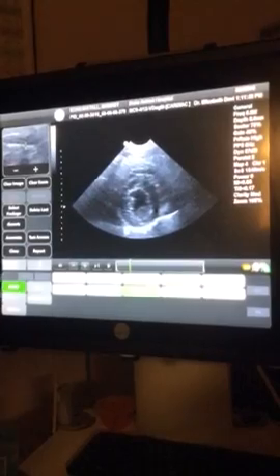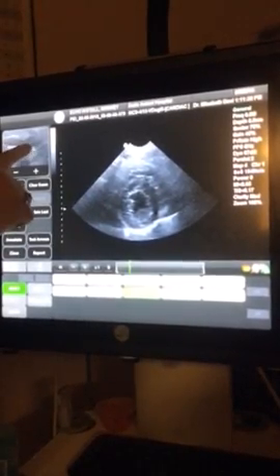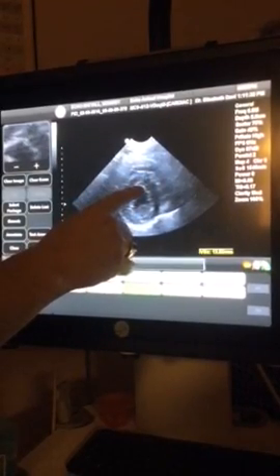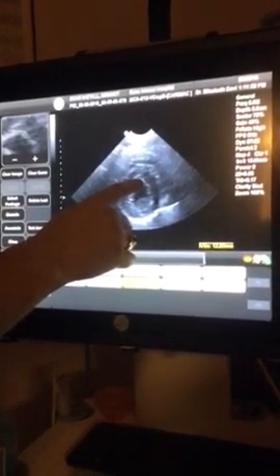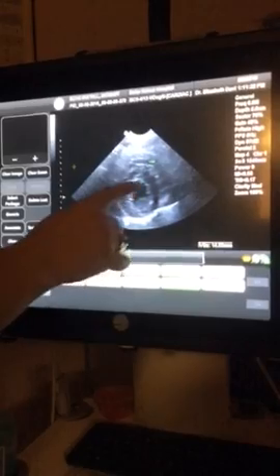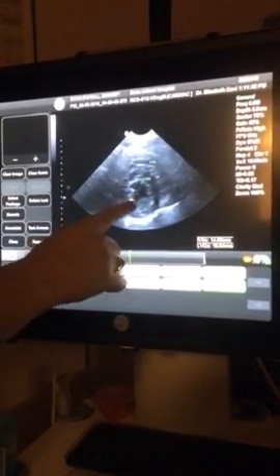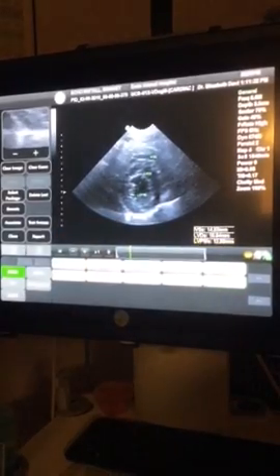We're going to go to the top of that wall. Again, if you need to make adjustments, you make them from up here. We're going to touch and drag that thickness. Again, we're not going to take our finger off until we're done. Now it wants to know inside the mushroom. We'll take that back down, and then down to the white line again for the pericardium.